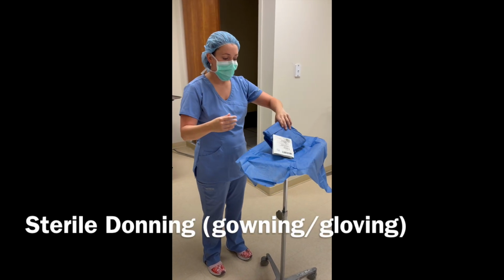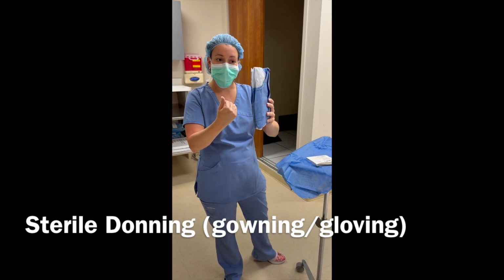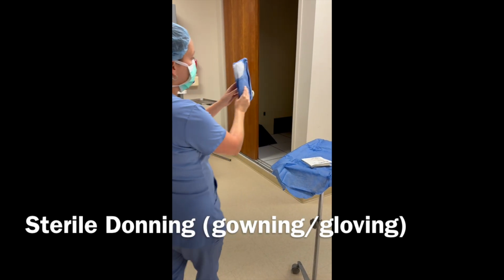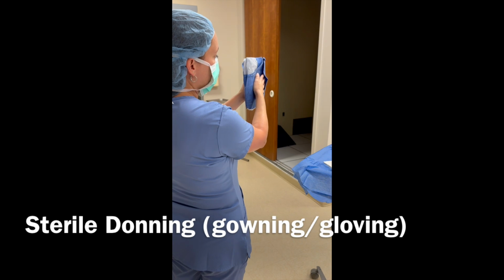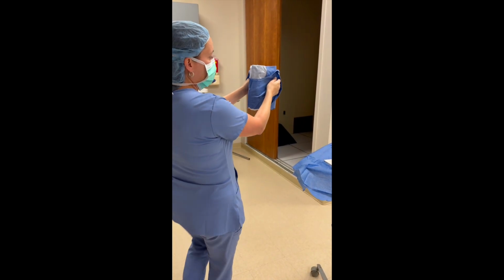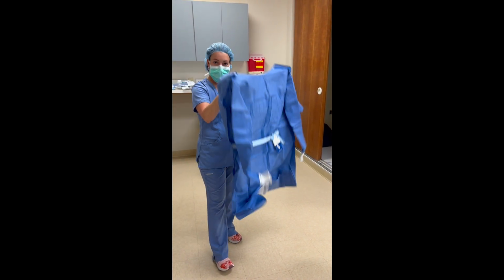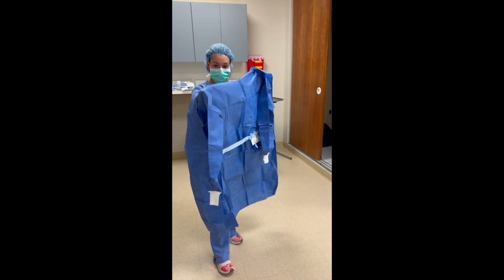So I'm going to grab my sterile gown. See the neckline right here? The neckline should always go towards you, all right? So the neckline goes towards you, then usually your hands go to each side, the right and left side, and that will be your arms, okay? So the neckline is towards me, facing towards me. I'm putting my gown on. Yeah, I'll shake it out a little bit, because if I don't, it's not going to do it.